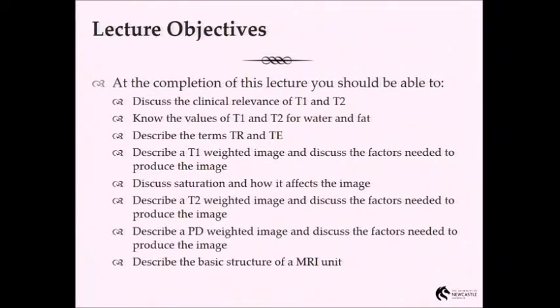Now there are a few series where people have looked at people who had normal non-contrast enhanced CT scans and done MRs on them, and on susceptibility weighted imaging they've found evidence of microhemorrhage. So it's just another technique, really weighted towards that T2 star effect, which is very sensitive for looking at things like microhemorrhage. It's also being investigated for things like blast injury, people exposed to roadside devices in wars, where they just want one quick test to see if they've been exposed to a brain hemorrhage, and that's the technique they've chosen to use.